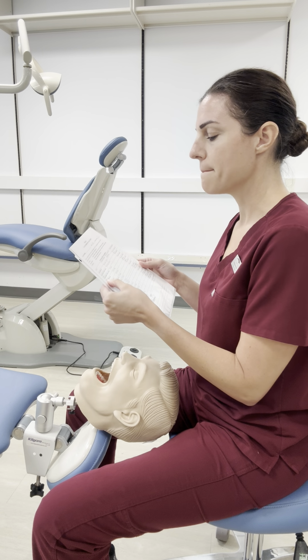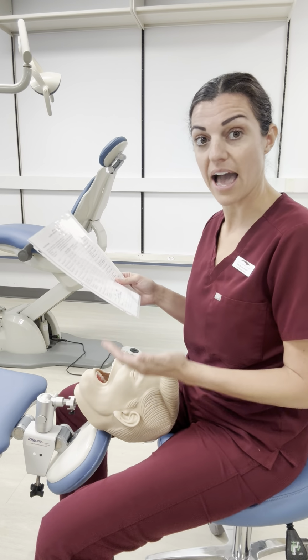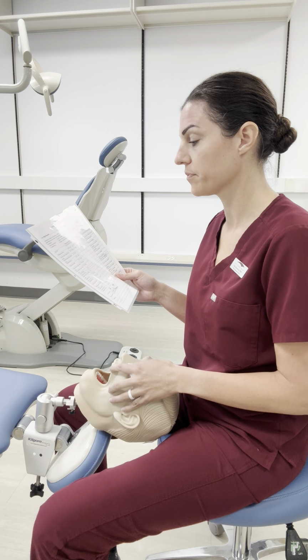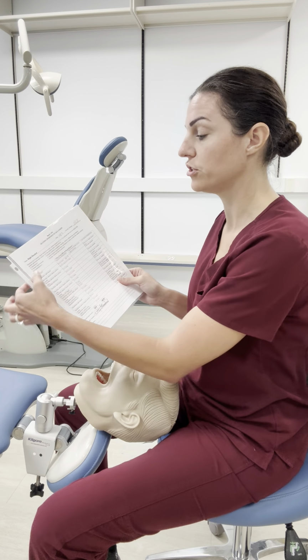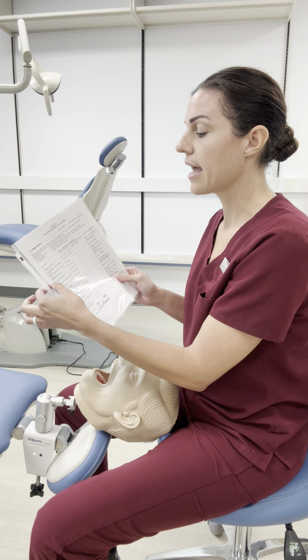All right, and then we've got the maxillary left buccal. Sorry, I skipped one. Maxillary anterior labial surfaces away. So again, we're going to be at 12 o'clock for these away surfaces on the maxillary anterior, okay? The patient again is going to be chin up and neutral. So that was just that third box there. We just went over that third box, okay?